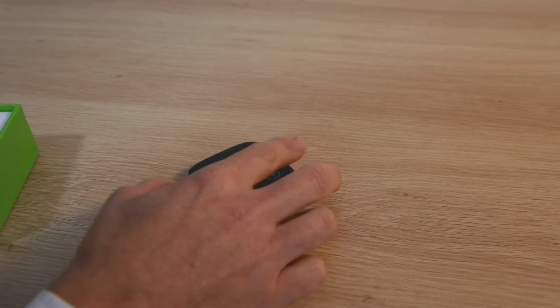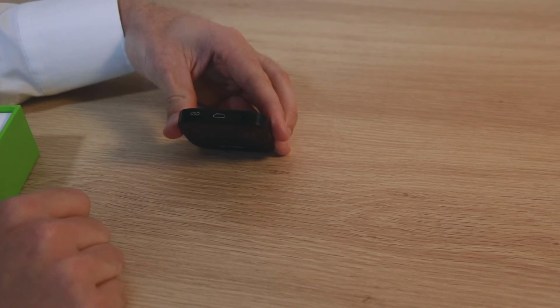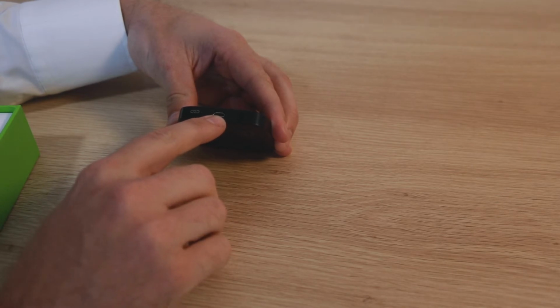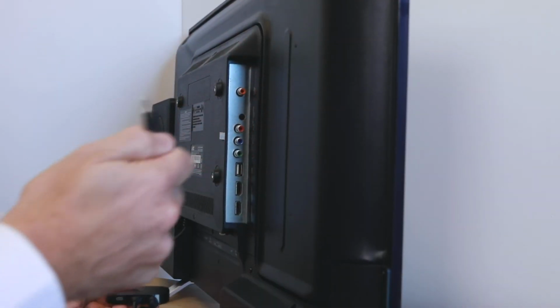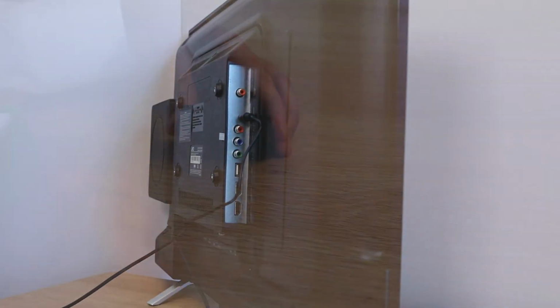When we turn the device around, you'll see a couple of key components here. There's two wires that will go in. One of them is the power and one is the audio. This is your power here. That's a micro USB, and I'll show you that cable in a second. And this cable here goes into the back of your TV, and that gives you the ability to transmit the audio to this device, which then transmits that to your hearing aid.